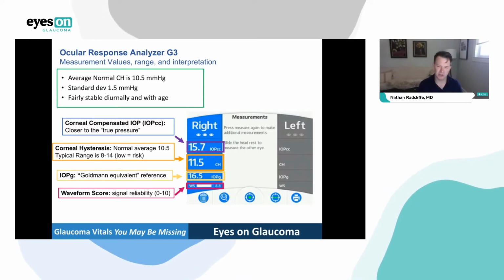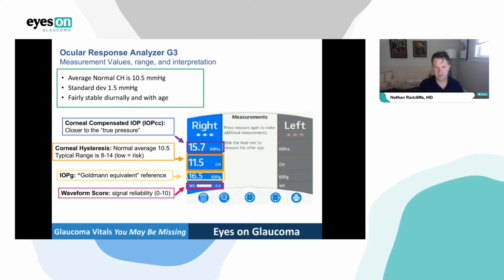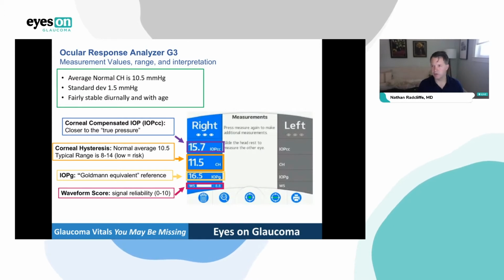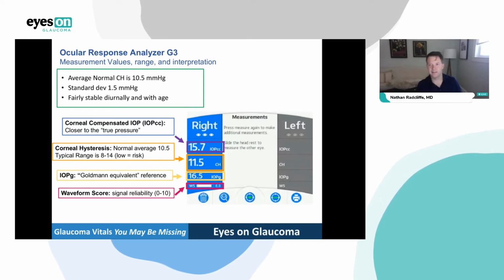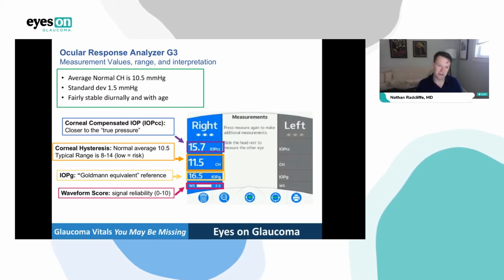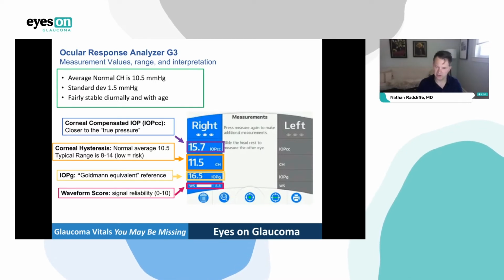But it really is, because it's something you can't see that's messing with the accuracy of your measurements. And so we have to measure it in order to make adjustments and in order to interpret the patient's pressure accordingly. The machine also gives you a waveform signal, which is a 0 to 10 value on how good the quality score is. And if you want a good example of what waveform score is, it's just like the Cirrus OCT signal strength. It's not that a 6 is a fail. It's still a very useful OCT. It's just not as crisp a signal as you get when it's a 10. So, I use OCTs with signal strengths of 4, but I keep in mind the signal strength is a little low. Same with waveform score.